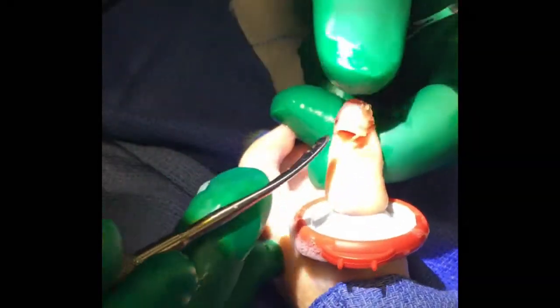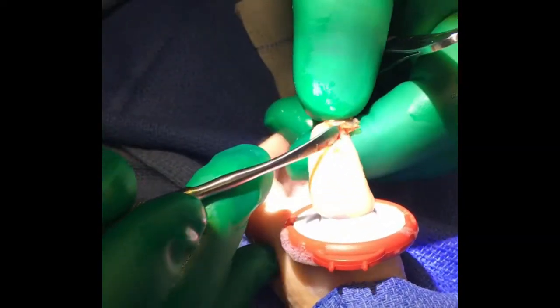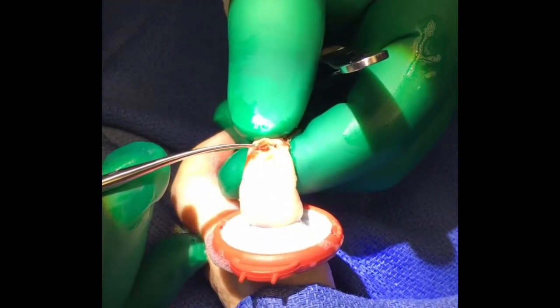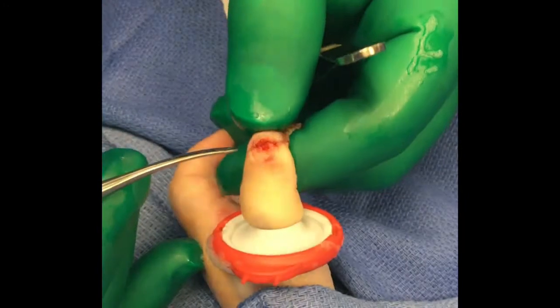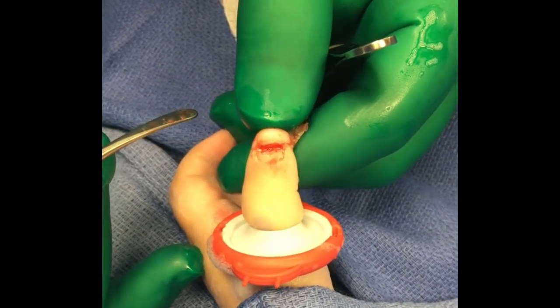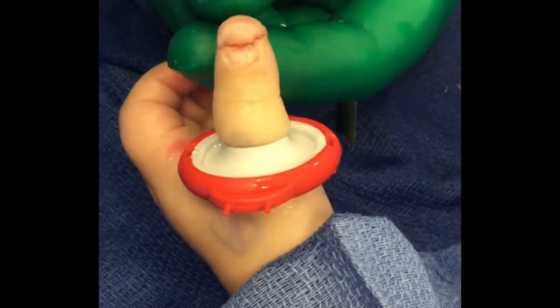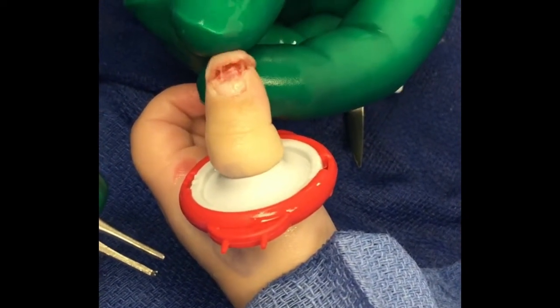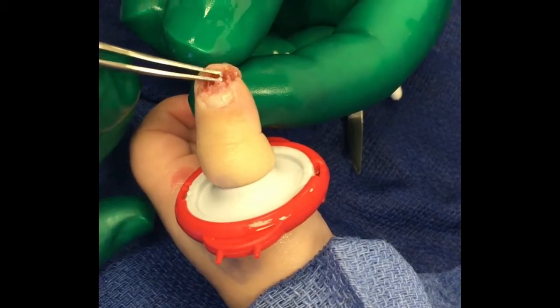To start, go ahead and peel that nail off. Use the freer or a blunt instrument like a pair of scissors by spreading, and that'll give you full access to the open nail bed and open distal phalanx underneath. You can see there's a transverse laceration here. Booking it open gives you exposure to the open distal phalanx fracture, which you can then copiously irrigate.